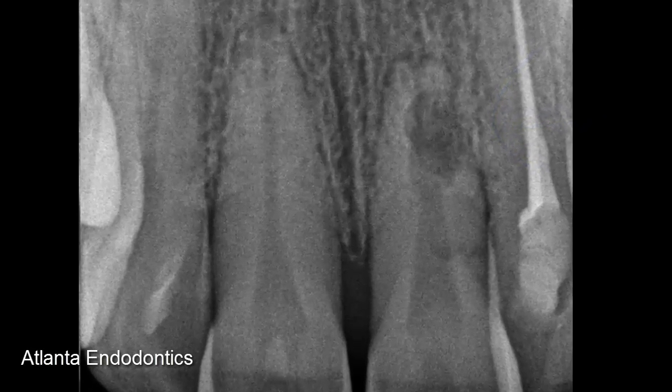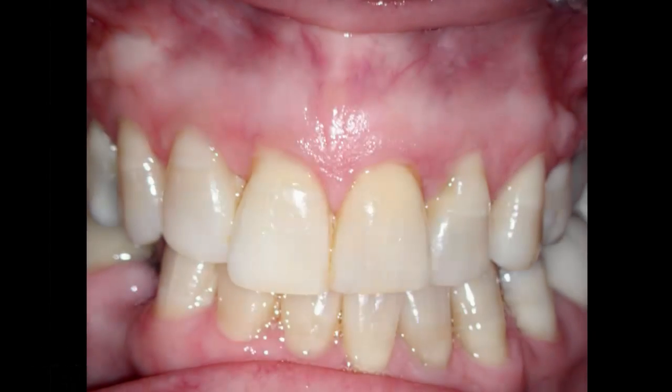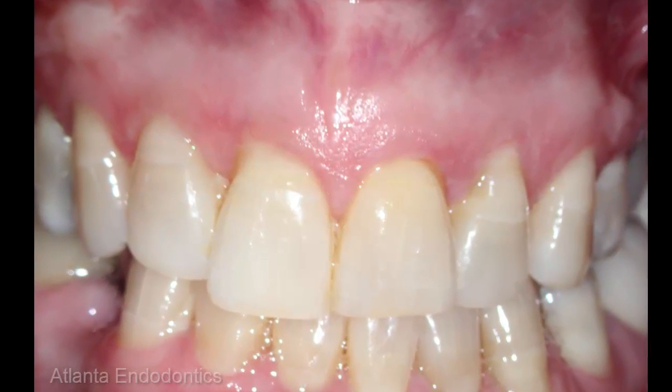In this case, we've made the decision to treat the upper left central incisor, which has advanced internal root resorption apparent apically. Here's the clinical image, and you can see aesthetically it would be quite a challenge to replace that tooth.